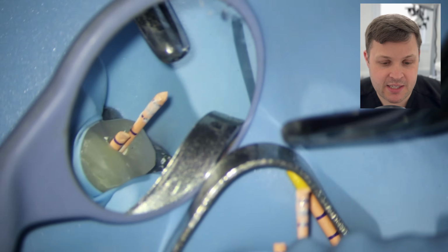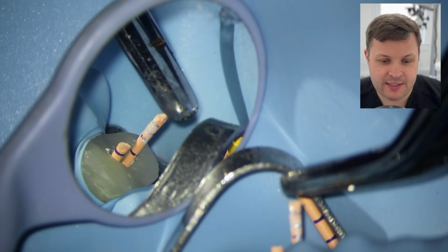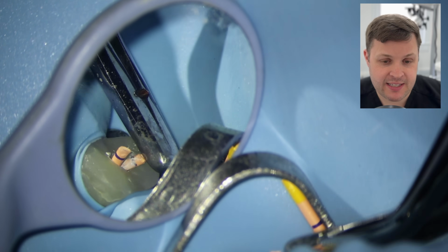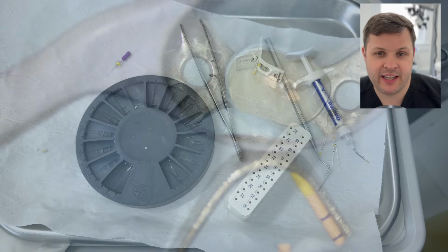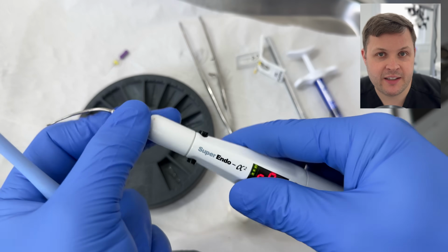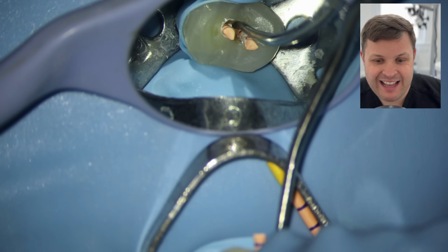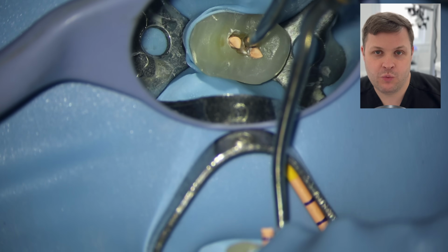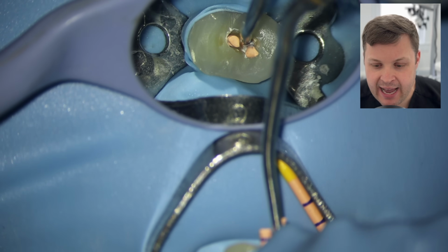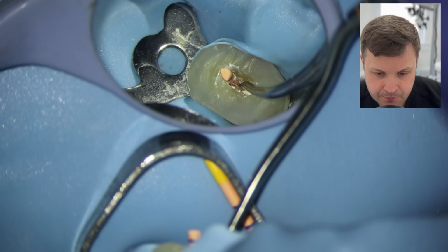Sometimes you'll notice that despite the bioceramic taking 4 hours to set properly, you can get a bit of a residue on the cone, and I didn't want to make that an issue trying to get it back in the other canal. So I just wanted to get it in the canal as quickly as possible, and then we're just going to remove the excess with our heated plugger.